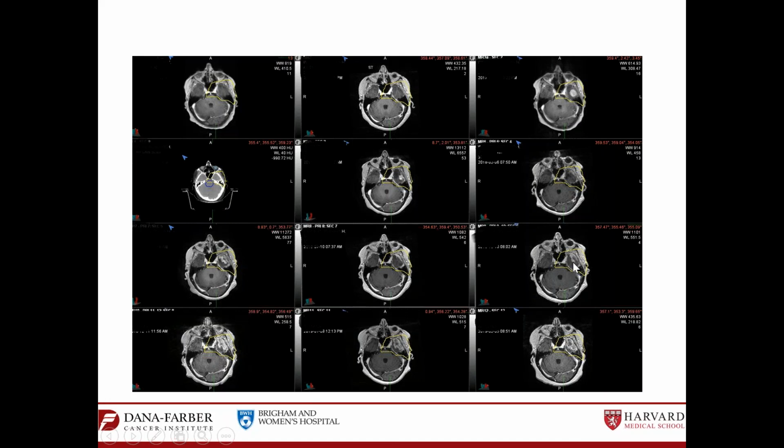You can see this area of enhancement is irregular in shape. It's more towards radiation necrosis, but the patient was really symptomatic, and we cannot taper off dexamethasone. If she is off dexamethasone, she will have very serious symptoms. So what we do at this point, we send her to surgery, and there was surgical resection, and it comes back as radiation necrosis, comes back as dead cells, okay? So that's one case scenario.